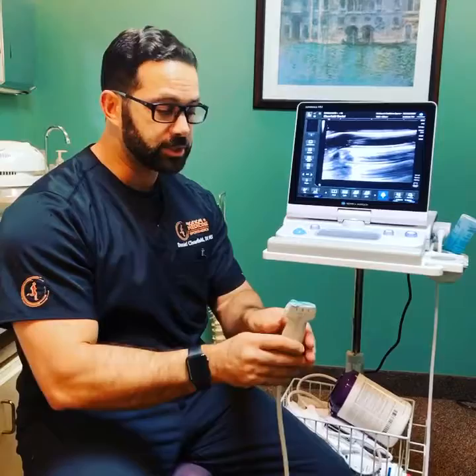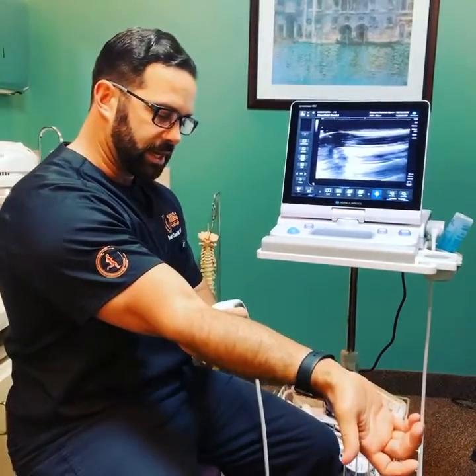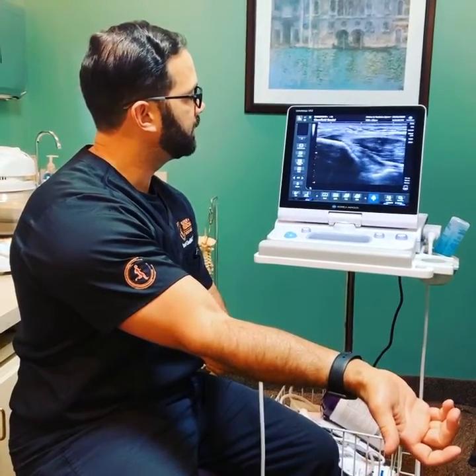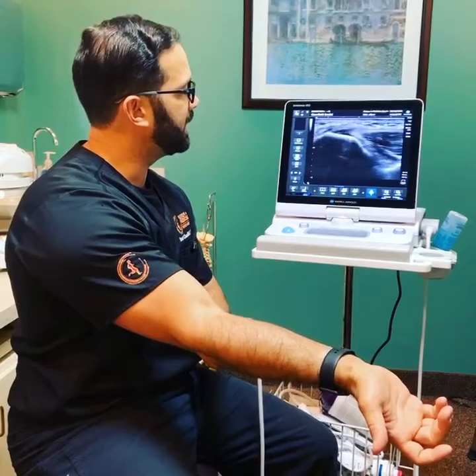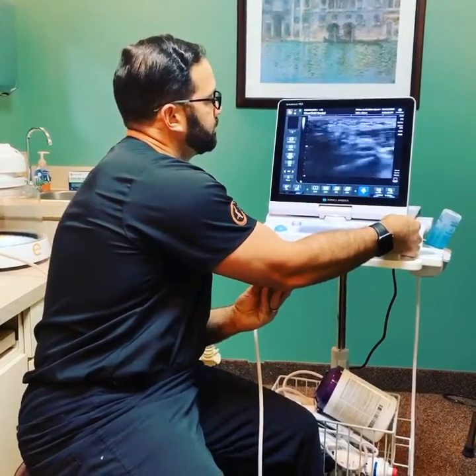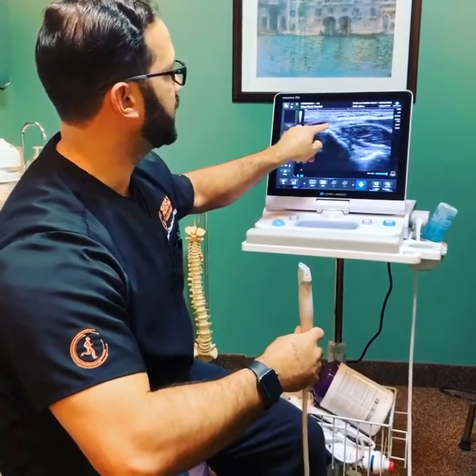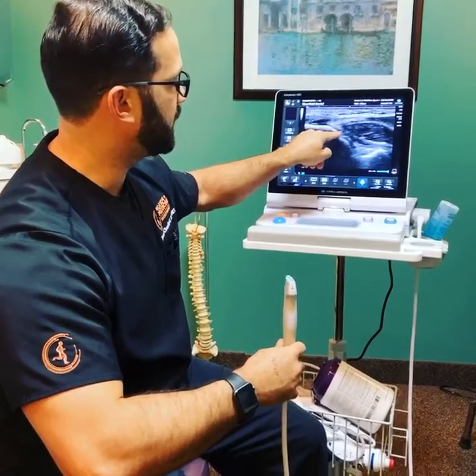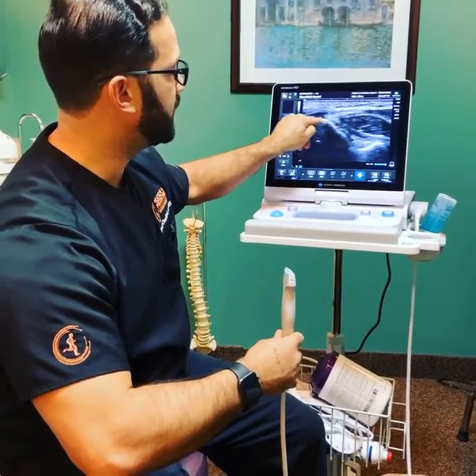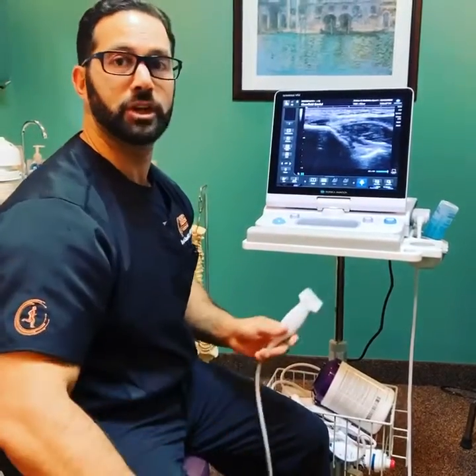I'm just going to be surveying the area. I've already scanned it with the ultrasound prior, but just to confirm my spots over on my medial epicondyle that I'm going to be going over here. We can see the area and the area of disease. We're going to be really targeting this area here. On earlier scans I had also seen some disease tissue right over in this area and a little bit of a partial tear that extends out over here, notably with contraction. So I'm going to be targeting all those.